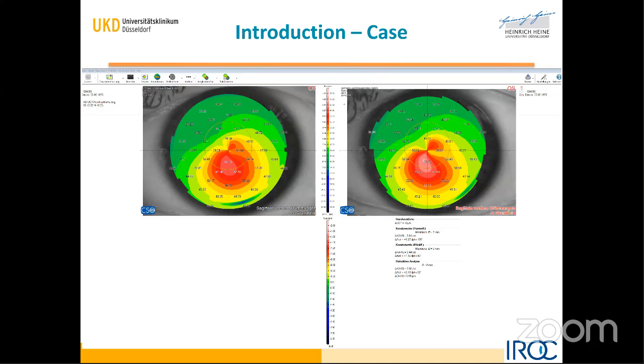The big advantage of the Gaussian map is that the Gaussian is fixation independent. So I guess that you should have exactly the same results between the right and the left image if you look at the fixation map. That's why we are basing our Kmax now not on the tangential, but on the Gaussian. The Gaussian map is just about the real bulging.